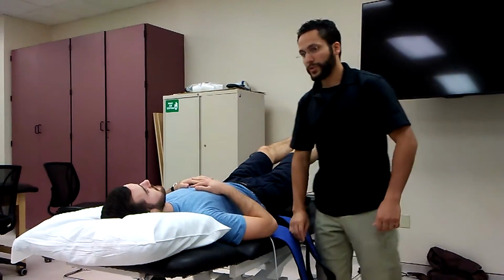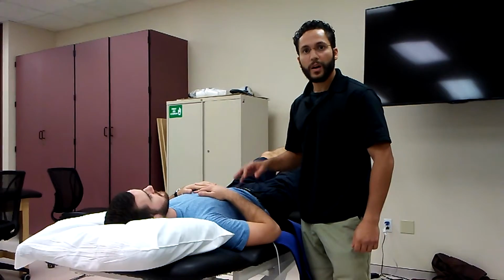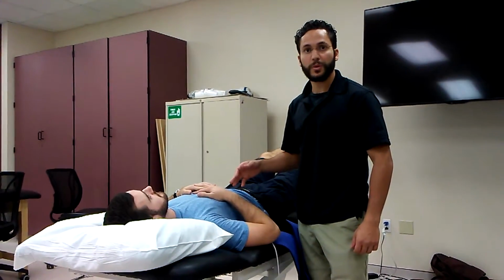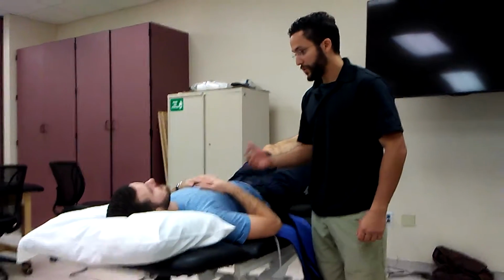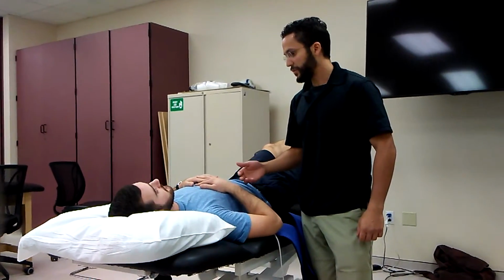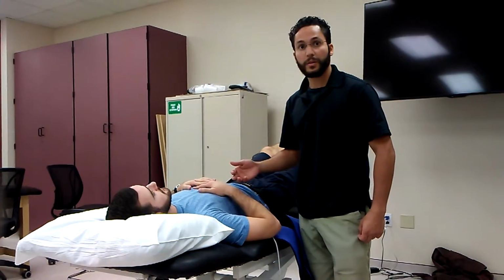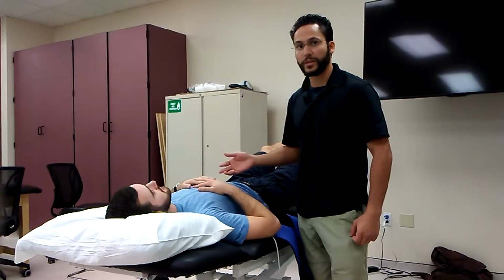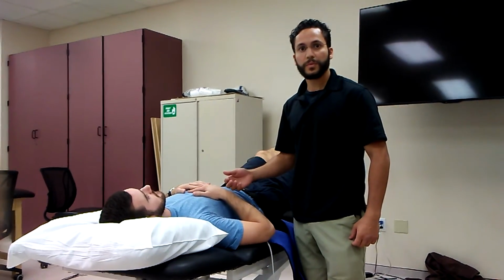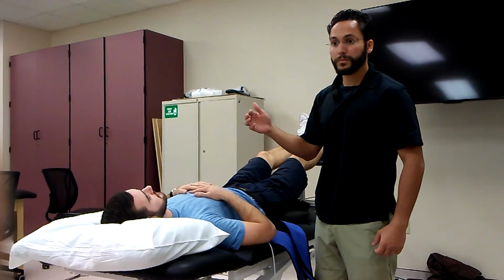And what should he be experiencing is reduced muscle spasms, reduced pain, and I'm going to check to see if he has increased range of motion in his lower back. So has your pain decreased? Yep. And the muscle spasms, have they resolved somewhat? Yeah, I feel better. Excellent. So then my next course would be to check to see if his lumbar flexion extension has improved, and then stay with the treatment or progressing from there.